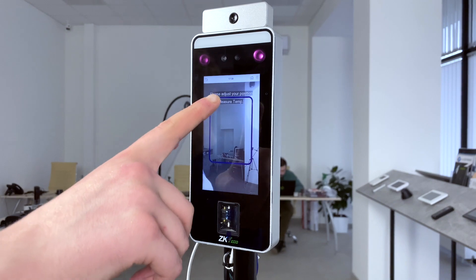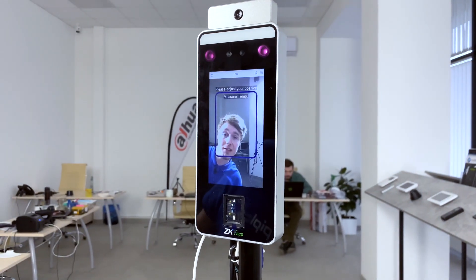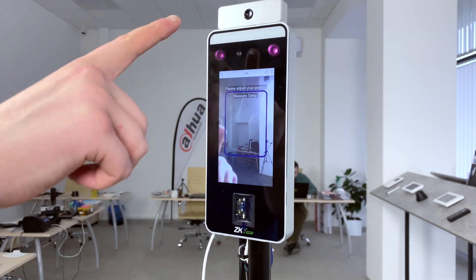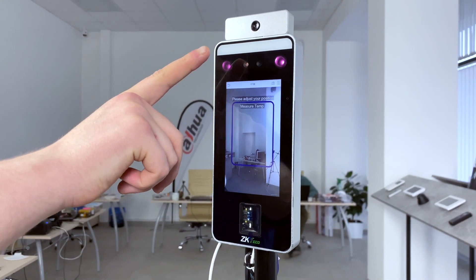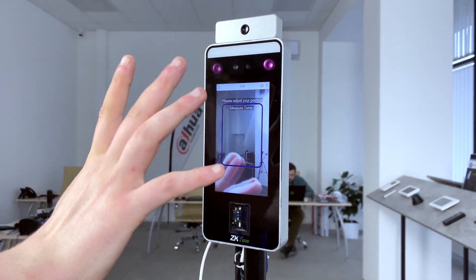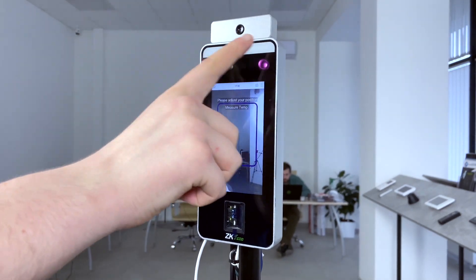Even from the start I want to sanitize my hands. This is a five-inch touchscreen, activated by faces — there we go. This module on top measures body temperature with an accuracy of about plus or minus 0.5 degrees Celsius. This white line is a flash to light up the scene at night.